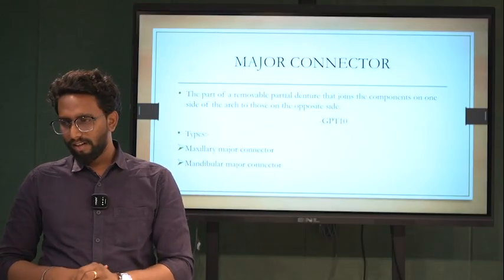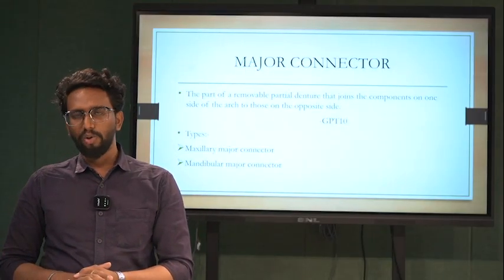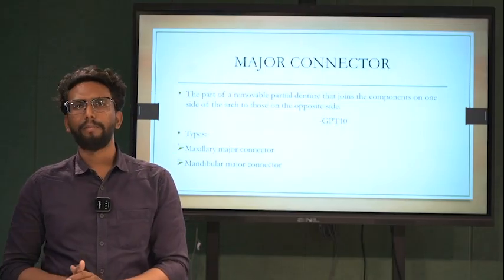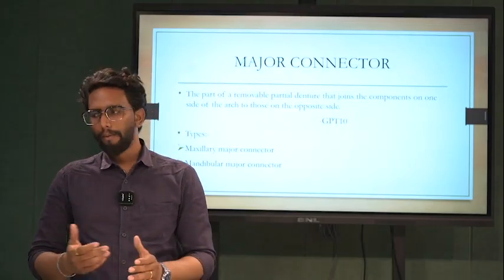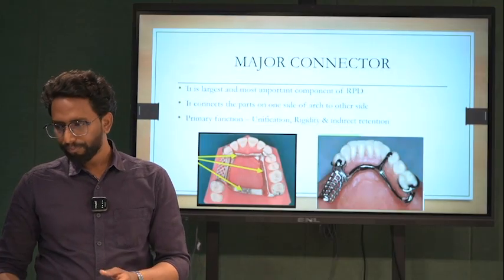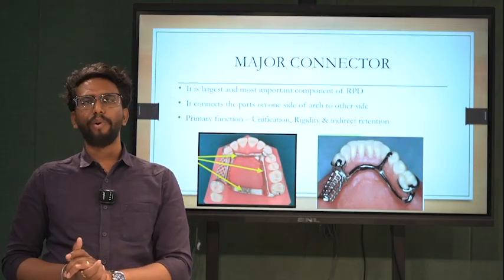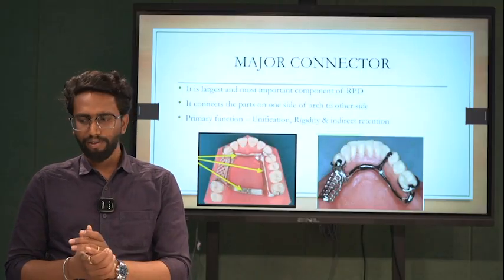Major connectors are also of two types, a maxillary one and a mandibular one, meaning maxillary major connectors and mandibular major connectors.